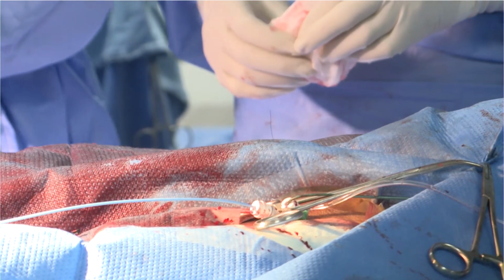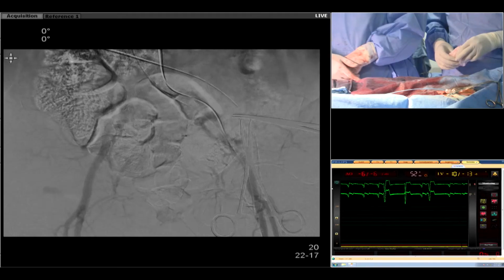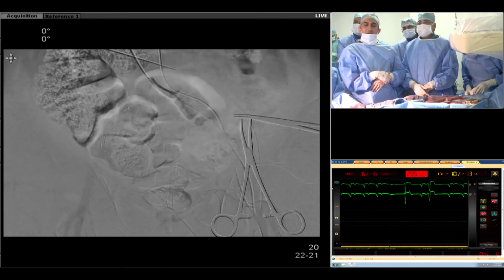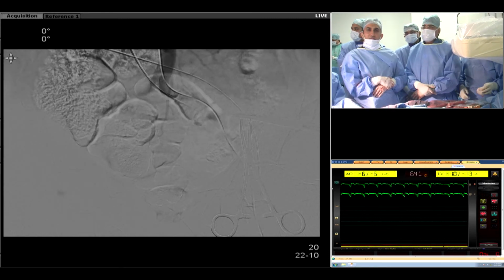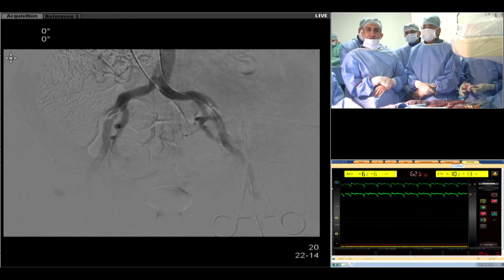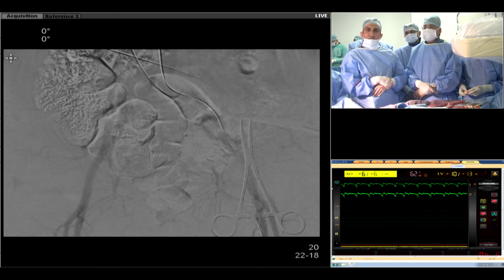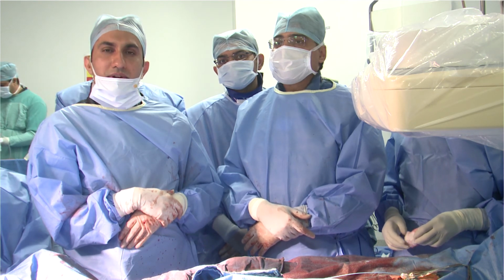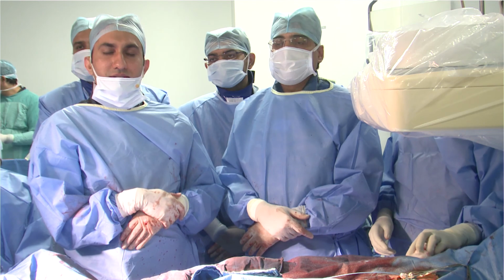I think that was a successful transcatheter balloon expandable aortic valve implantation using a percutaneous approach from the right common femoral artery using 3 proglides, and no perivalvular leak at the end, no gradients, good LV functions, no pericardial effusion, no groin complications. I would like to thank the scientific committee of TCT for giving me this opportunity to present a novel transcatheter aortic valve implantation. Thank you very much.